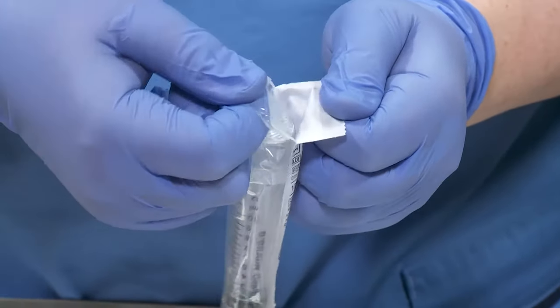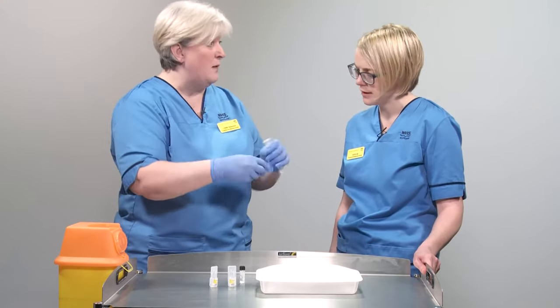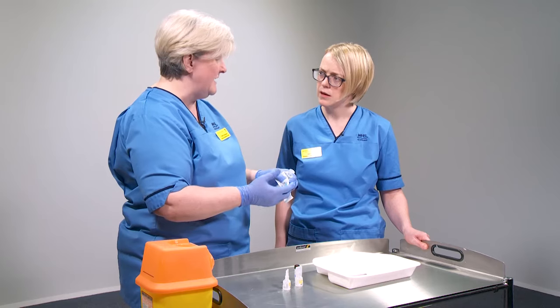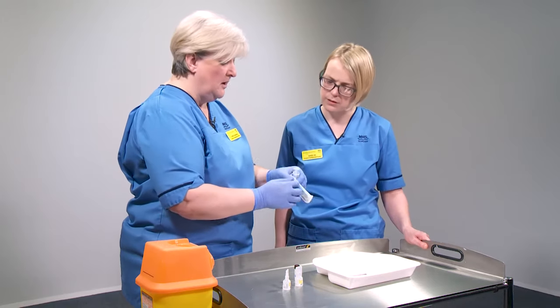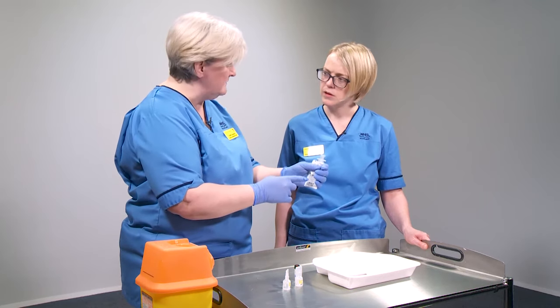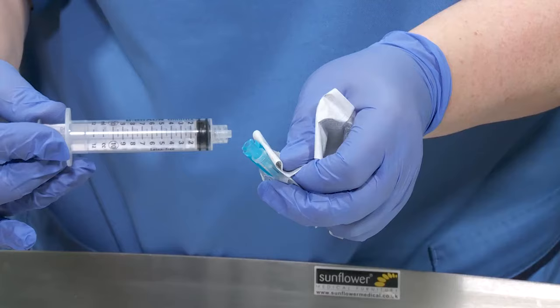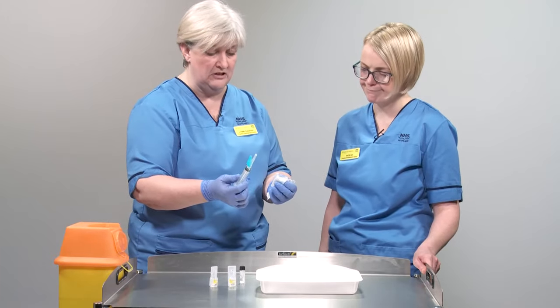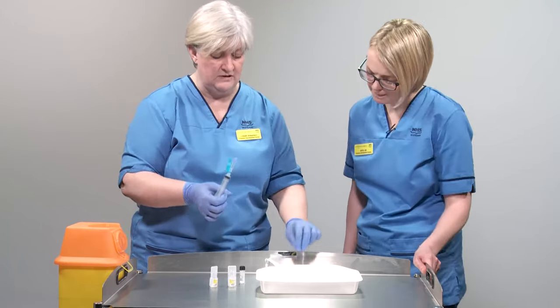Next, open up the needle and syringe for the flush. It's important to peel them open rather than bursting through — thinking about aseptic non-touch technique, ANTT. The key parts we're protecting are the tip of the syringe and the hub of the needle. By peeling open the packet, I'm keeping the syringe in its sterile packet, then peeling open the needle and going sterile to sterile — nobody's touching it, it's absolutely free from contamination. I'll keep hold of the packet for now and you'll see why in a moment.